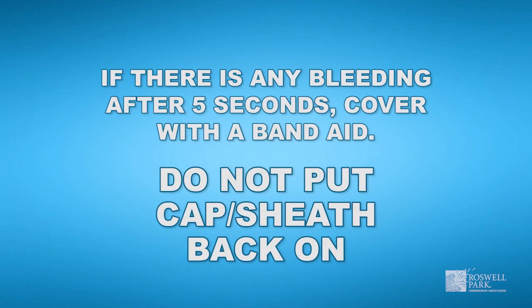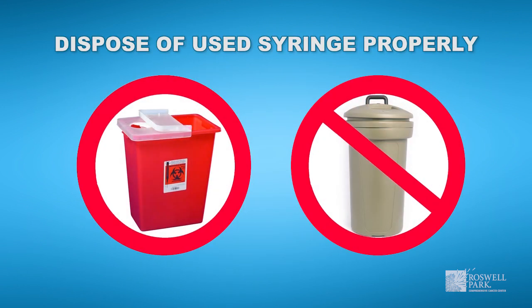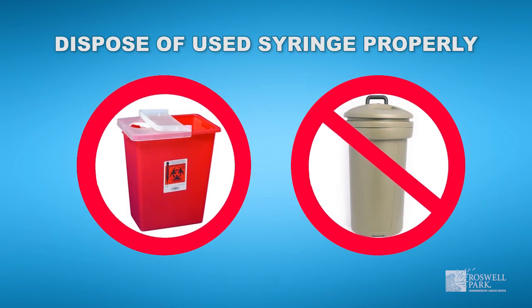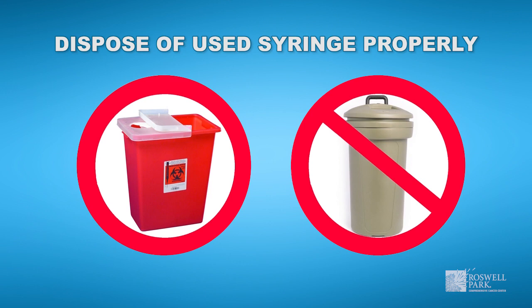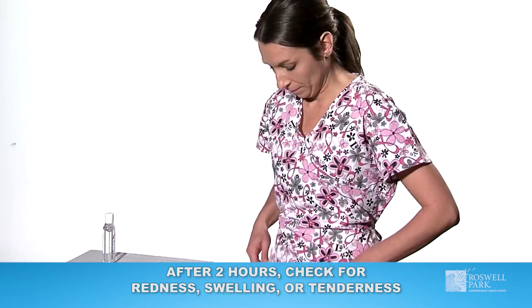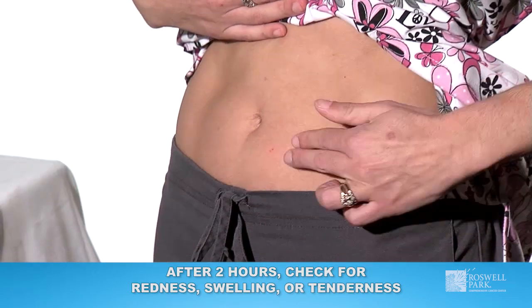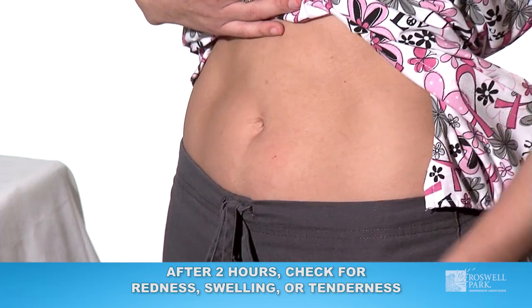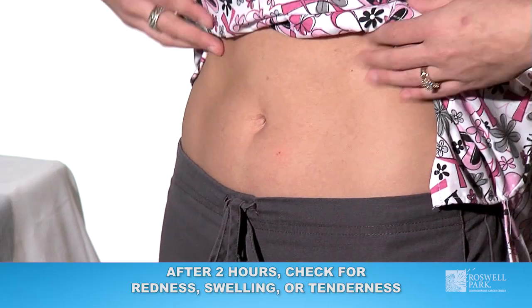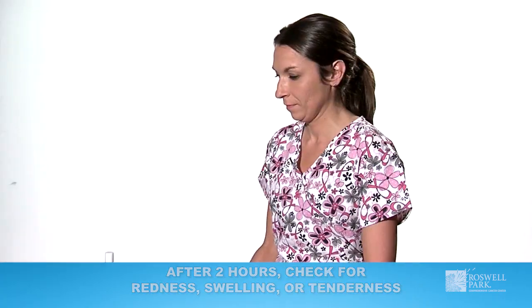Do not put the cap back on. Dispose of the used syringe in a hard container right away. Do not dispose of the used syringe in the garbage. After 2 hours, check the injection site for any signs of redness, swelling, or tenderness. If any of these signs are present and or do not go away in a few days, notify your clinic.